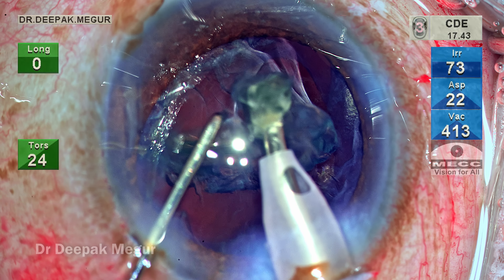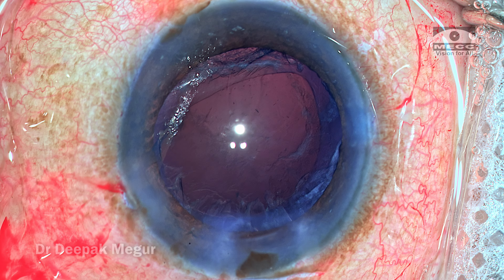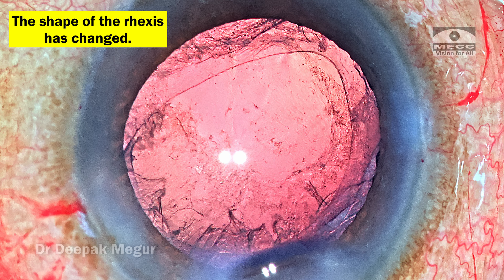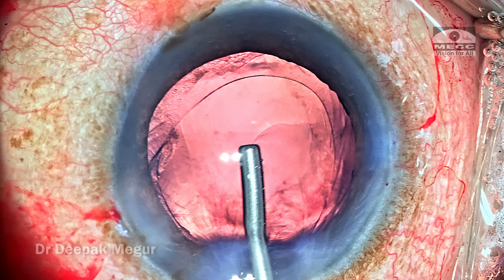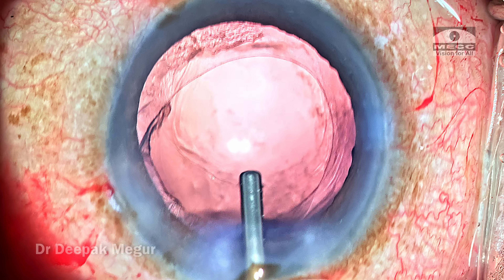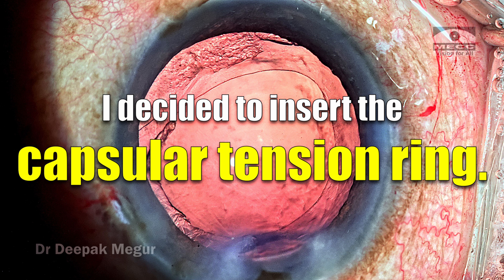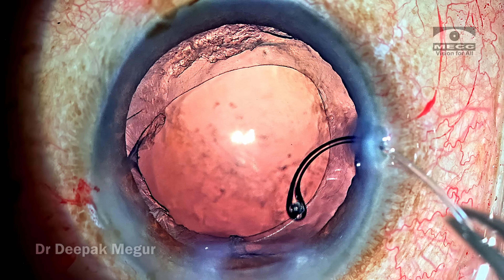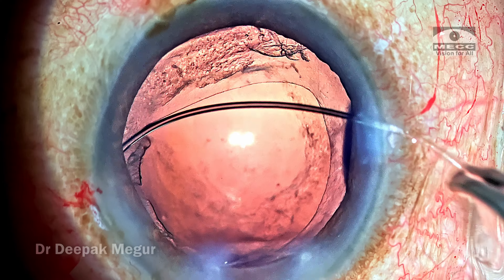The last piece of nucleus followed by the epinucleus is removed. I go in with my irrigation cannula to flush the posterior capsule as I typically do, but I find something unusual — the rhexis edge appears deformed and is no longer round as before. Using retro-illumination mode, it's clearly oval. I deepen the capsular fornices with OVD and it looks a little better. The change in rhexis shape led me to suspect zonular weakness, so I decided to implant a CTR at this point to support the capsular bag, stretch the bag equator, and help prevent fluid misdirection.